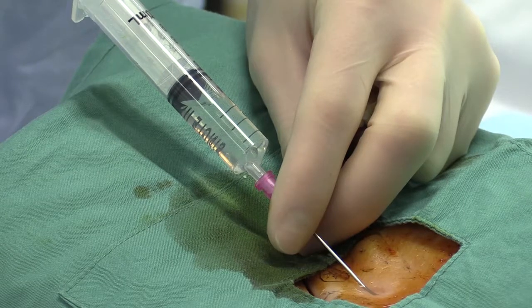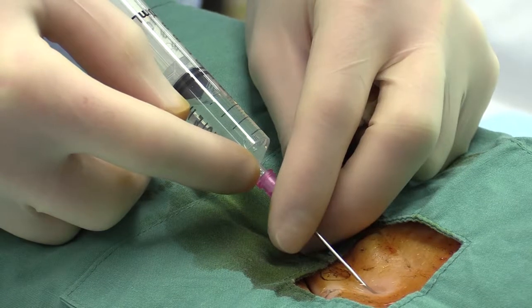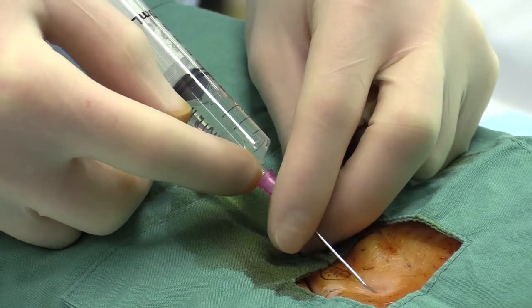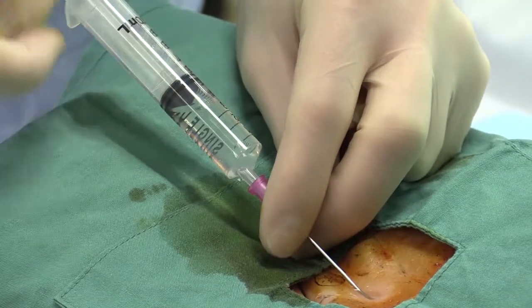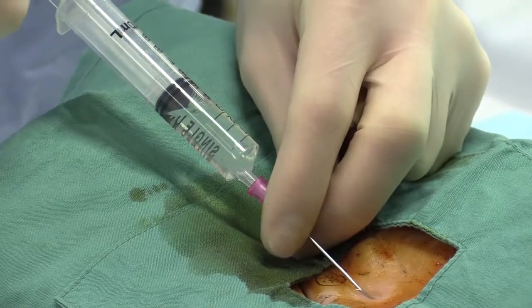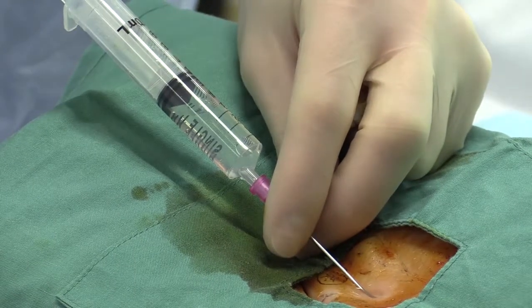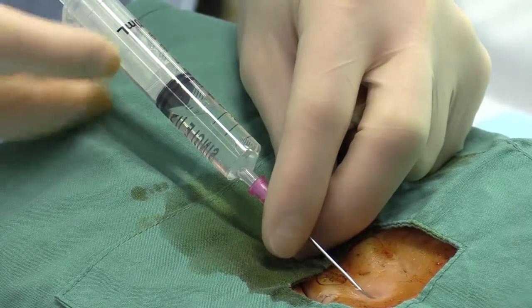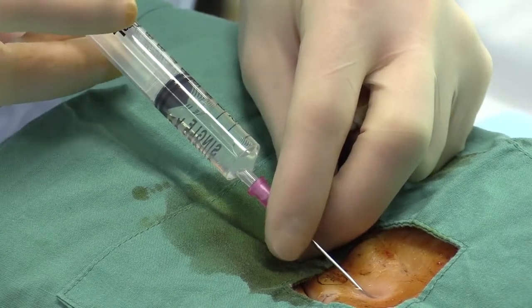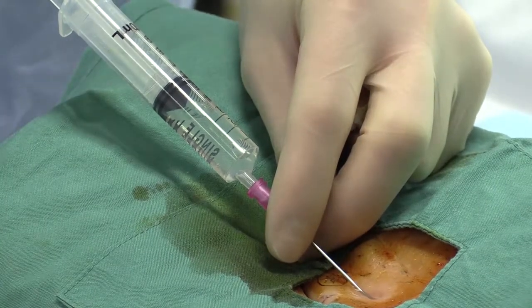position and requires repositioning. Sometimes air can leak in between the hub of the needle and the syringe, so you might find a small air leak. If that is the case, resecure the syringe and try again. If there is a significant amount of air, particularly with particulate matter in it or a little bit of bile staining, definitely you're in the wrong position. You're probably in small bowel and you need to reposition the needle. That repositioning includes a complete withdrawal of the needle and reinsertion.